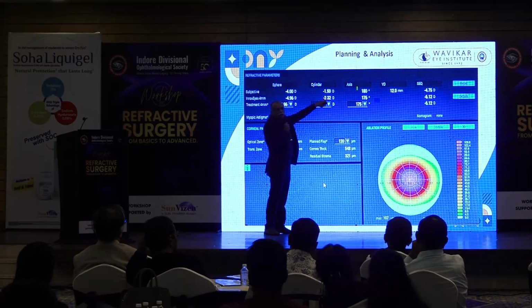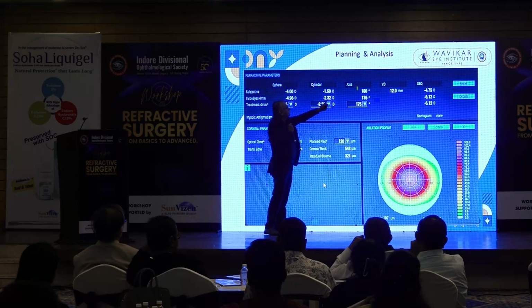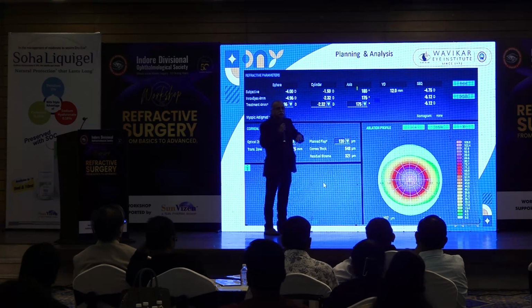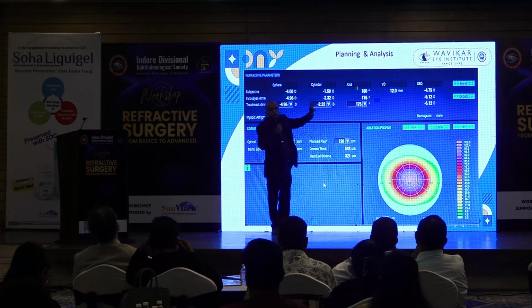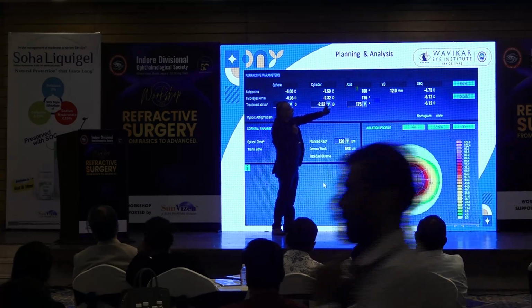And now this is the place. This is the question we are worried about. The patient has a cylinder of 1.5, aberrometry showing a cylinder of 2.32. First thing I will go to is the epithelial map. Okay, upper epithelium thicker, lower epithelium thinner by 3 microns. It is giving me a refractive error of 0.25. So in this case, the epithelium was good. Now, but in this patient, posterior corneal astigmatism was 0.7. So from 1.5 it has already gone to 2.2.